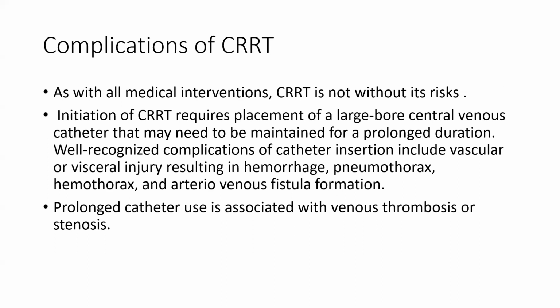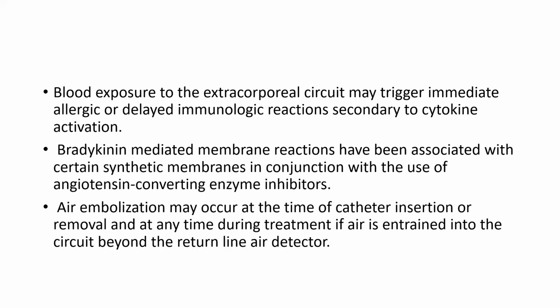Now, regarding complications of CRRT, as with all medical interventions, CRRT is not without its risk. Initiation of CRRT requires placement of a large bore central venous catheter that may need to be maintained for prolonged duration. Well recognized complications of catheter insertion include vascular or visceral injury resulting in hemorrhage, pneumothorax, and AV fistula formation. Prolonged catheter use is associated with venous thrombosis or stenosis. Blood exposure to the extracorporeal circuit may trigger immediate allergic or delayed immunological reaction secondary to cytokine activation.